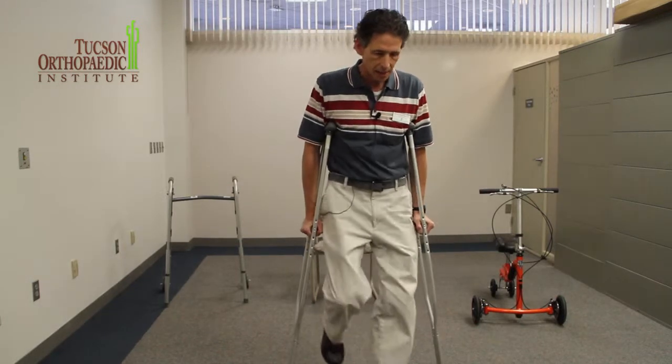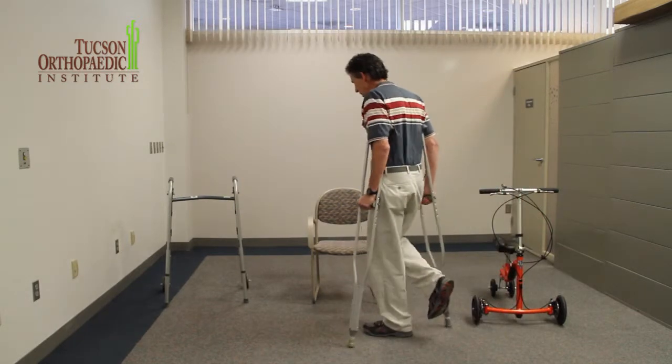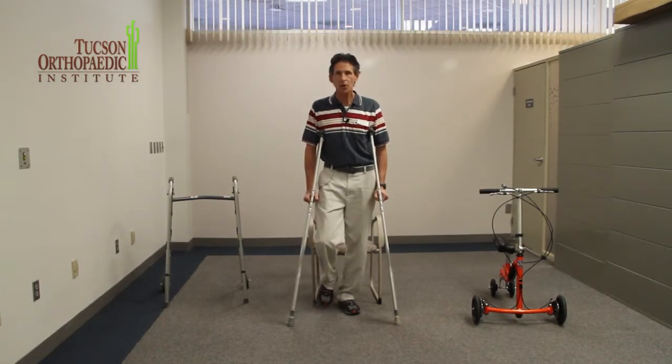So I'm just going to work my way back to the chair. I've done my little walk, and it's time to go back. What I'm going to do is walk up and then back up to the chair until I feel the back of my standing leg against the chair, so I know I'm pretty close.